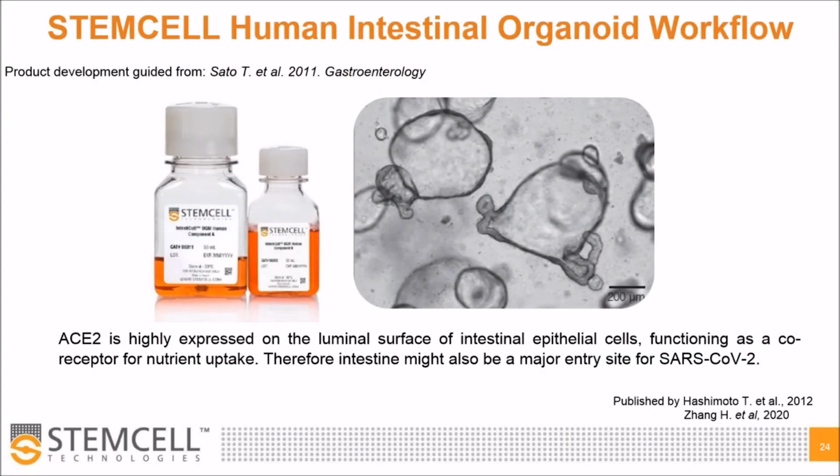Many studies and analyses of cases around the world suggest that the intestine might be a major entry site for SARS-CoV-2. It has been reported that patients who tested negative on the nasal swab came out positive for the presence of SARS-CoV-2 in their stool, unfortunately. And as you know, at STEMCELL, we have a nice workflow for generating human intestinal organoids.